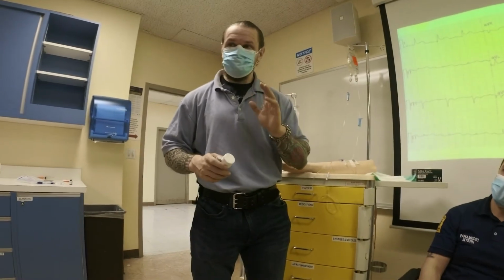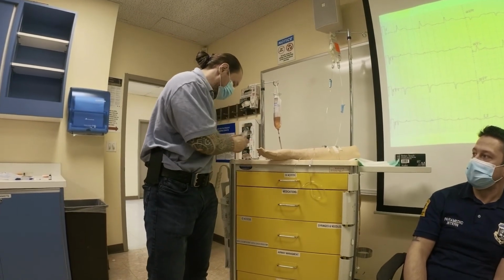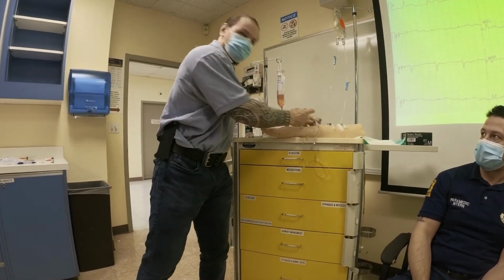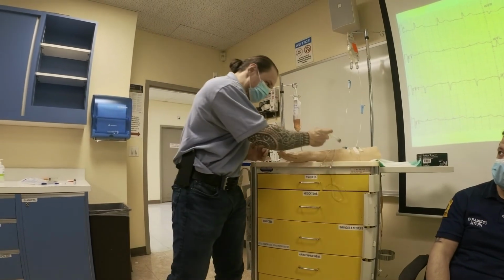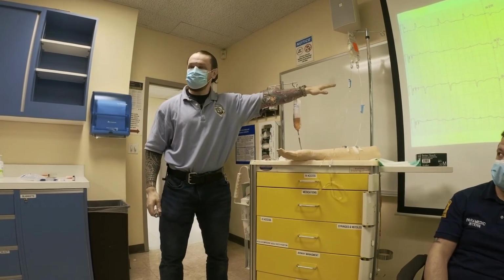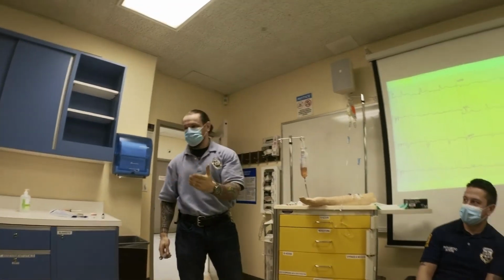A very important thing you notice when I was giving this drug, right? I did not do the following. I did not draw this medicine up like this, 150, and then push it like this. Everybody follow? Because when we do testing, a lot of you guys are adamant about 150 IV bolus, right? But for this condition, we got to give it over 10 minutes. Why over 10 minutes? Because of hypotension, right?